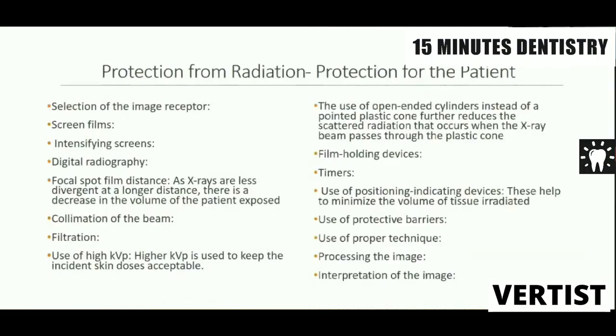First of all, the need to take a radiograph should be determined. When do you take a radiograph? If your clinical diagnosis or the treatment methodology will change after taking a radiograph. This is the same rule which you apply instead of taking a conventional IOPA and you refer a CBCT. You need to know the importance and whether it's going to help you in further diagnosis and whether the treatment of the patient is changed.